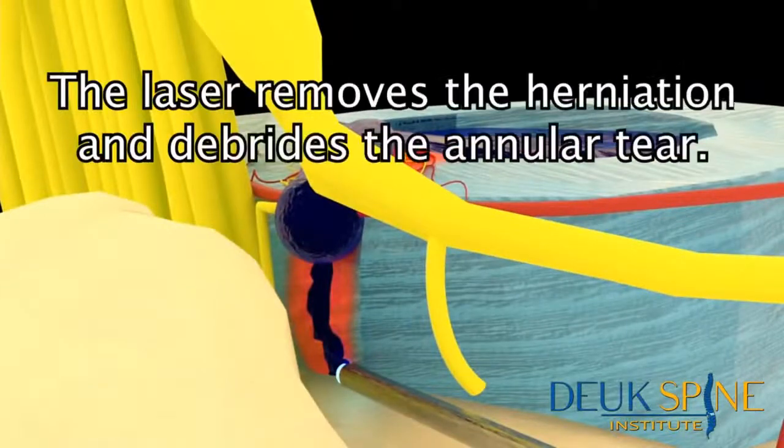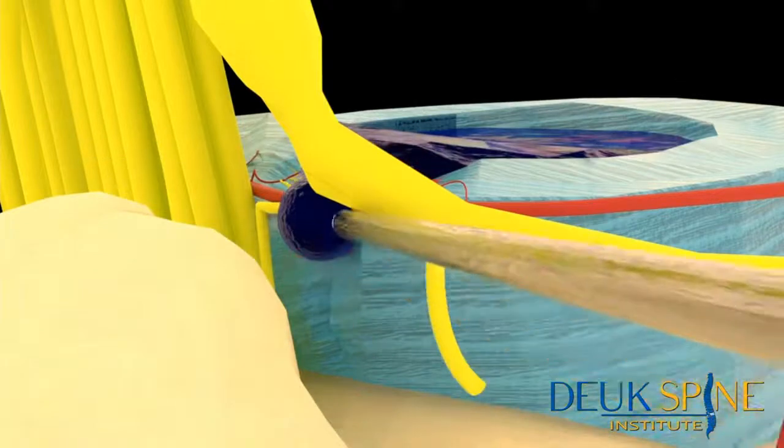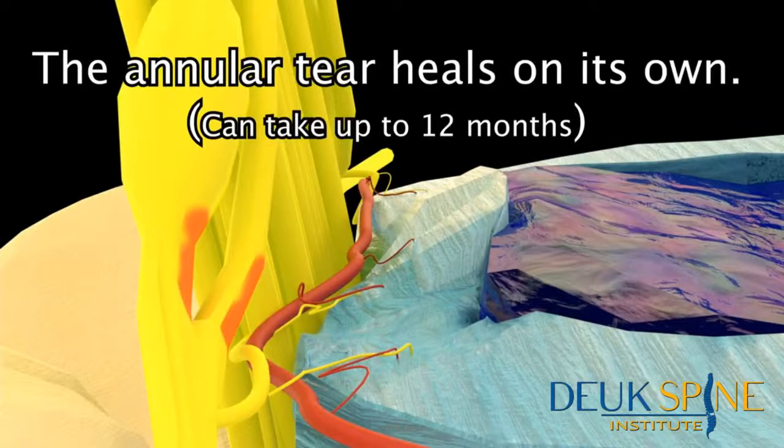The laser removes the herniation and debrides the annular tear. The annular tear heals on its own.